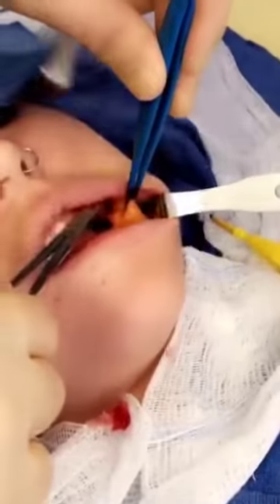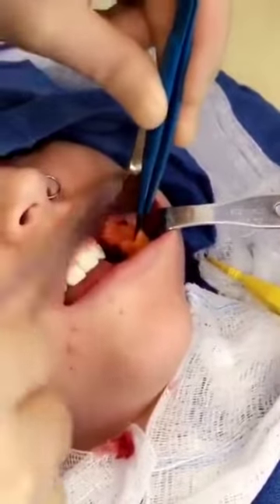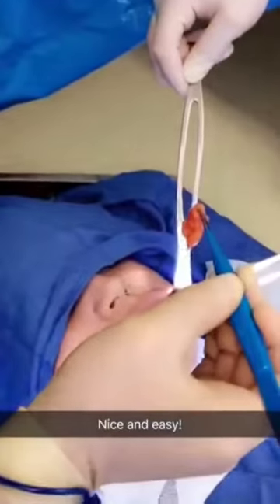This is the fat coming out of her cheek, and we're going to figure it out in a second. Just find a little bit there — and here we go, this nice little piece.